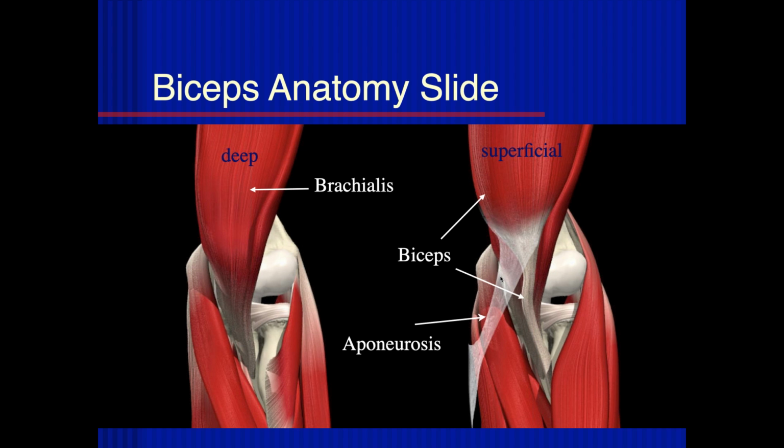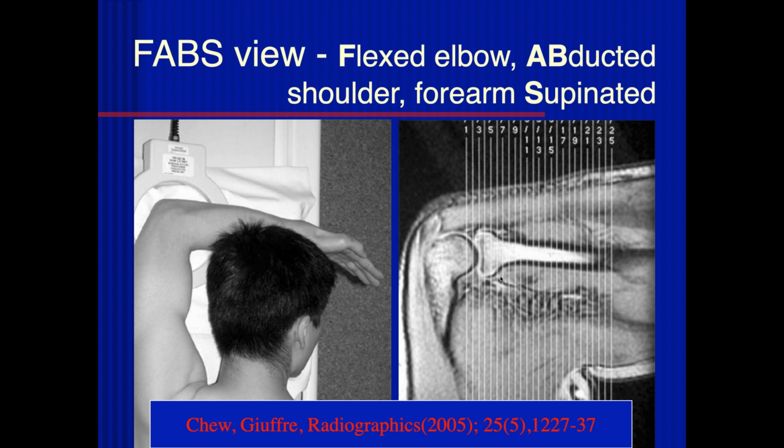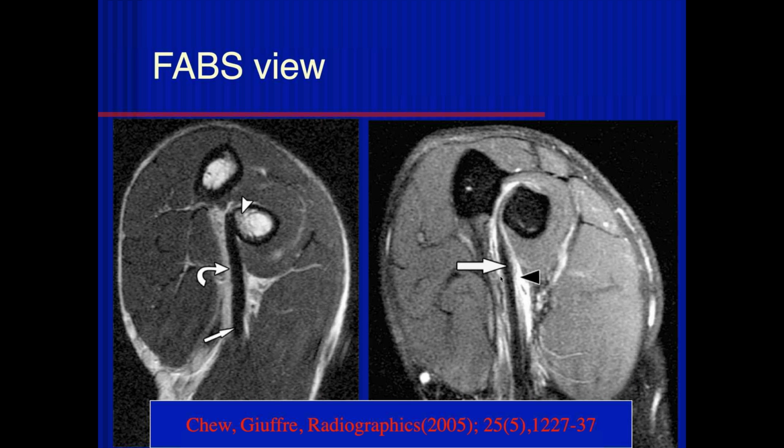Friday the 13th, even. So some people have described special views, the FABS view, for this. I don't think it adds anything. This is a very easy tendon, I think, to evaluate on our standard images, so I don't think we need to do anything special on the FABS view. I've done sports medicine all my life, never done that view. And then here we can see the biceps tendon coming down on the FABS view. You can see it attaching right to the tubercle. The one thing that we'll talk about in a minute is whether you pronate or supinate the forearm. That will change things a lot here.